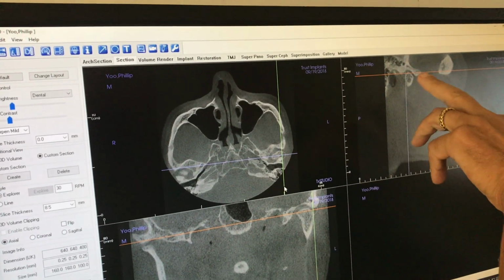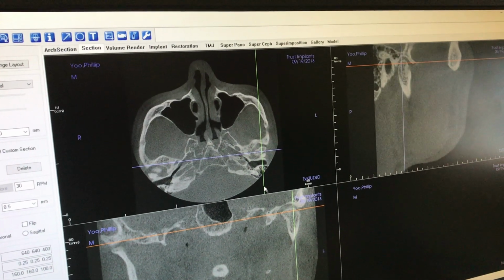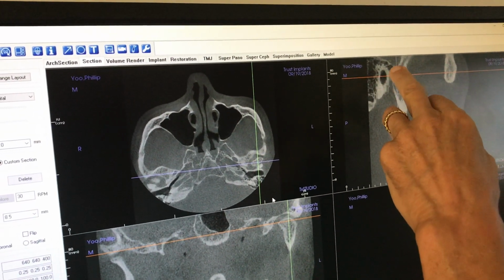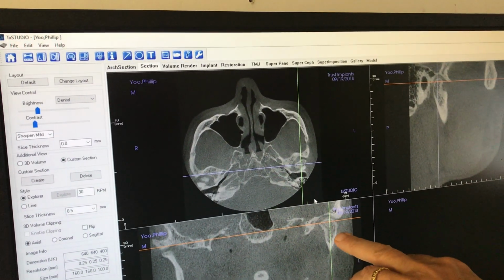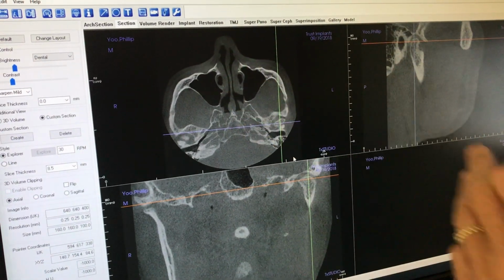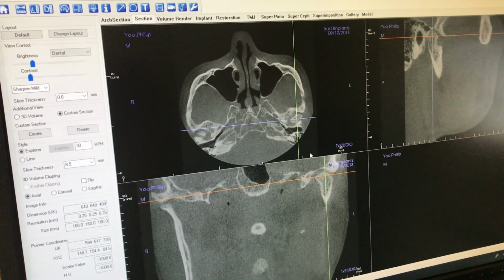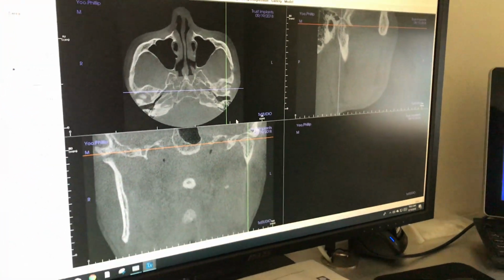So temporal bone, mandibular bone, temporomandibular joint, and you see how it's displaced distally? The space in back, it should be further forward, and so this is your left one, and it's displaced backwards. Now, what causes it to be displaced backwards is your front teeth didn't go out as far as they needed to go because of growth and development.